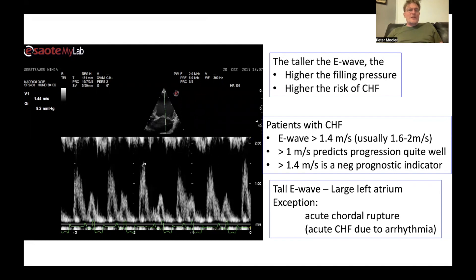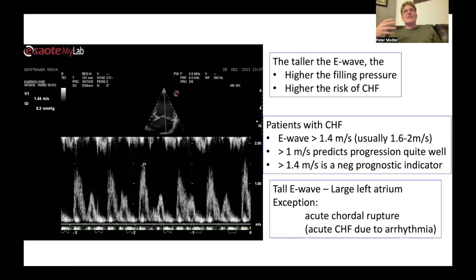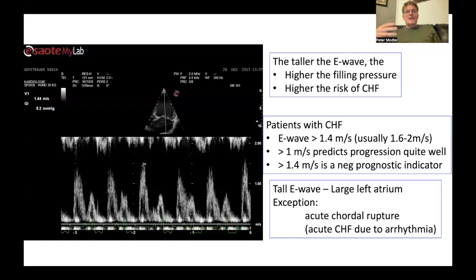A tall E wave usually accompanies a large left atrium, since it takes a lot of volume overload and disease progression to develop a very tall E wave. However, one exception is acute chordal rupture — if three or four chordae rupture at once, you get a very high degree of mitral regurgitation suddenly. The heart doesn't have time to enlarge, so you have a quite normal-sized heart with a huge degree of mitral regurgitation and a very large E wave. In these patients, mitral valve inflow tells you more than the size of the left ventricle and left atrium.